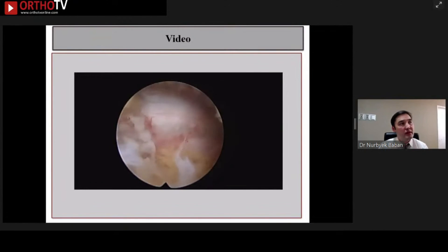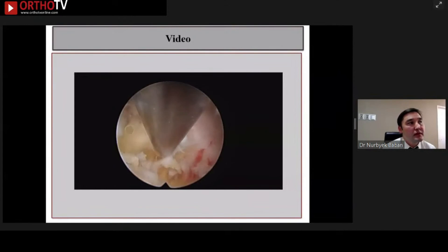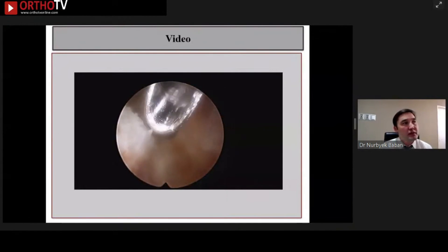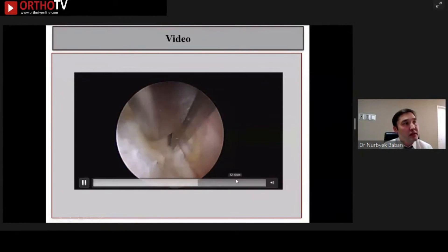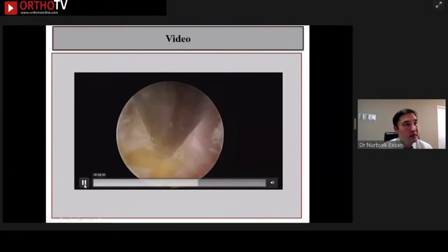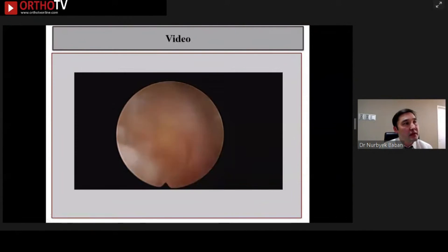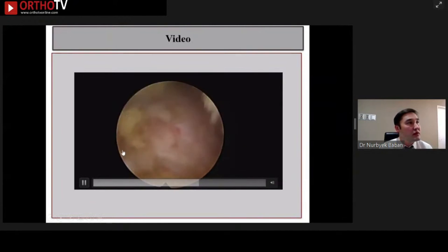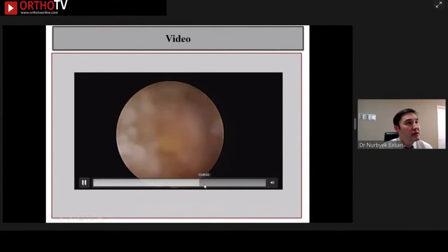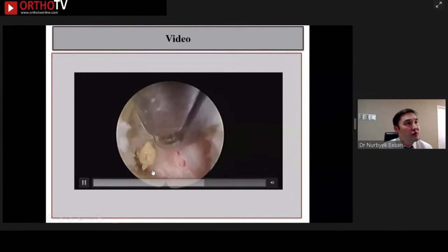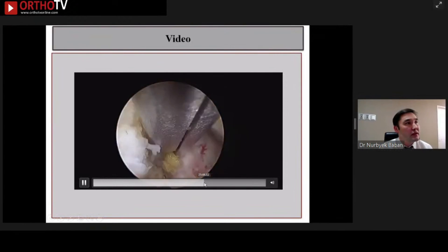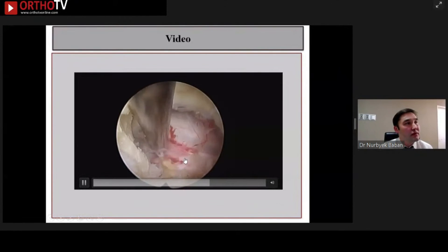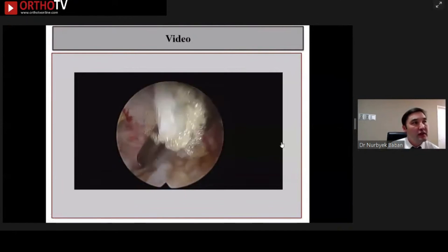I try to release scar tissues. I recorded this video specifically for this presentation. I cleared the area like that. Otherwise, I would not clear such bone and scar tissues in routine practice. I want to show that this fighting — meaning identification — of the SAP is important, because this is the SAP landmark. It makes the target clear. I am using the instrument like that, and clearing for demonstration purposes. Otherwise, I would not clear these tissues routinely.